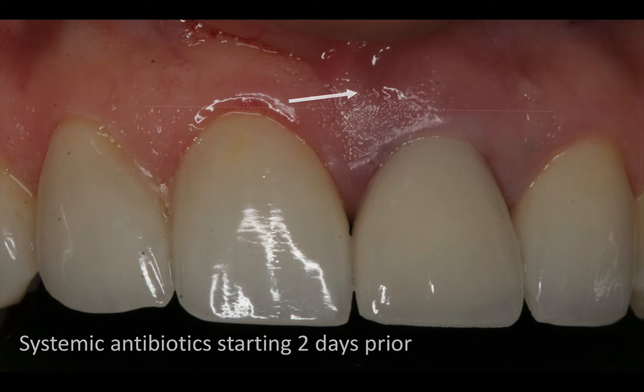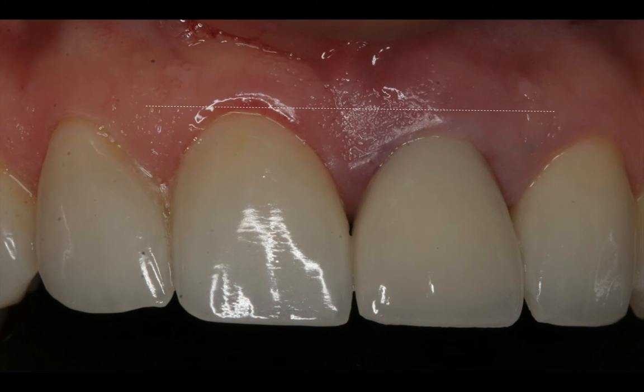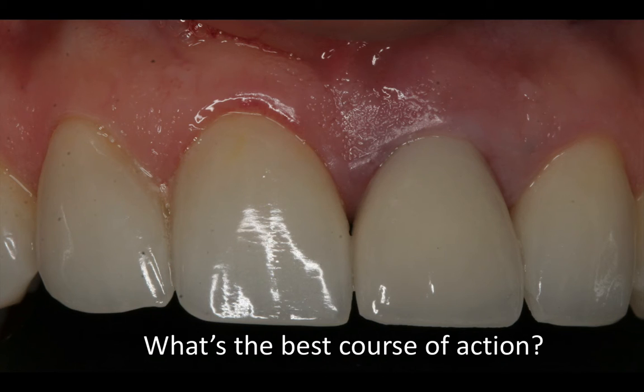But you need to educate them that this antibiotic is just helping to alleviate some of the symptoms and help in the healing process. Now, I know it's a disaster, but one good thing is that tooth number 9 that we're about to extract actually has a little bit more soft tissue on the buccal surface, which is a good thing because we know that once a tooth is extracted, we're going to lose some soft tissue and bone. And having some extra is actually a great sign and encouraging. So what is the best course of action? What should we do next?